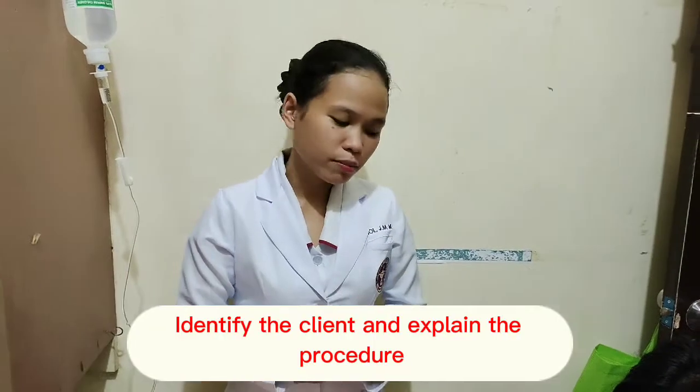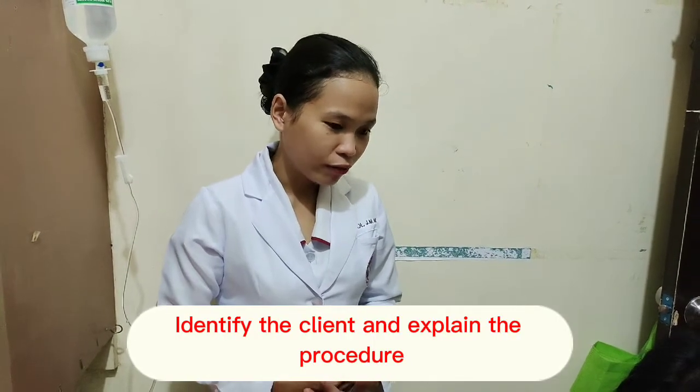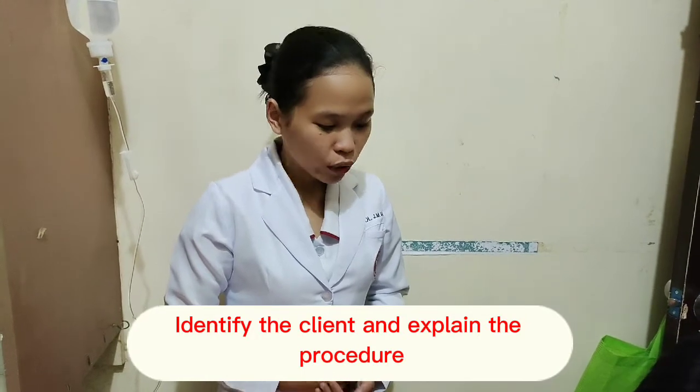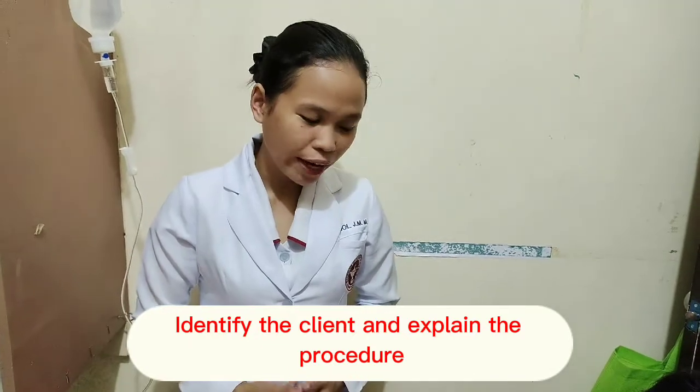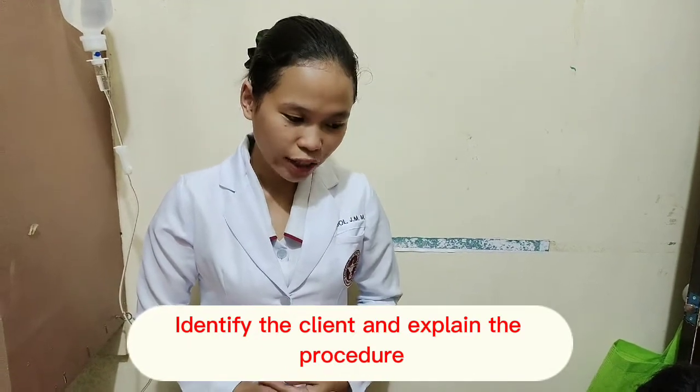Hello ma'am, I am Jess Kiol, your student nurse for today. I am from University of Mindanao. What is your name ma'am? Sam. I am going to give you an IV fluid on your hand to maintain your electrolyte.